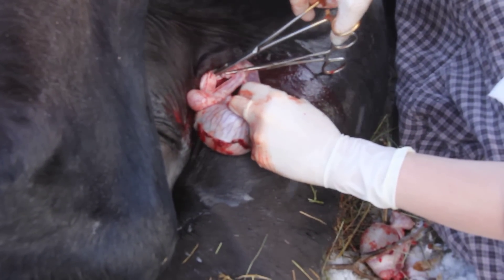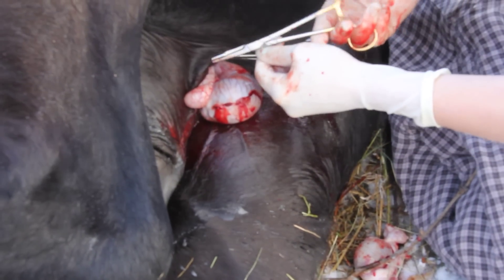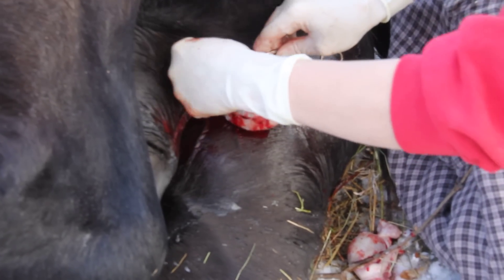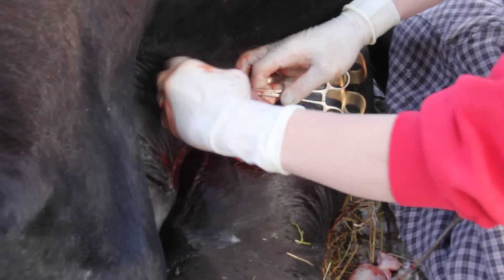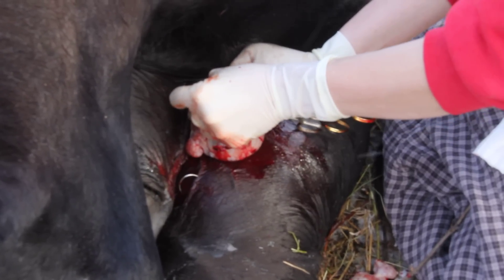The reason that we use those emasculators is they clamp and crush at the same time, as well as cut. So any smooth cut you get a lot more bleeding. Whereas if you get that crushing action, you get a lot less. You get just the clottal form — it cauterizes it better.